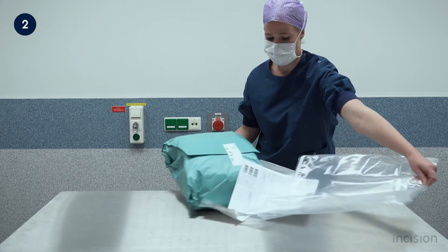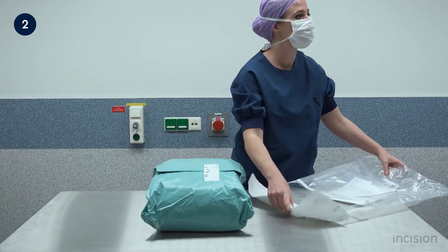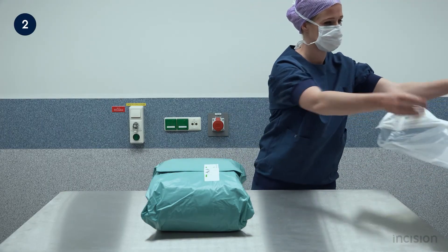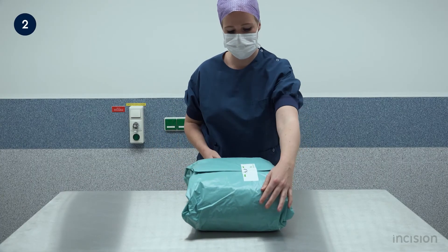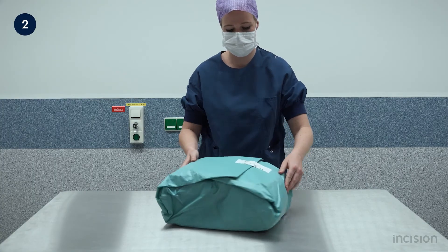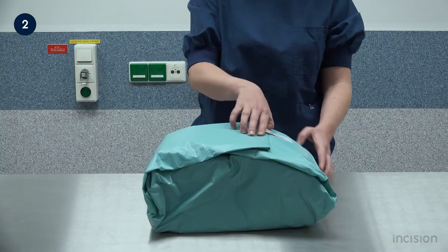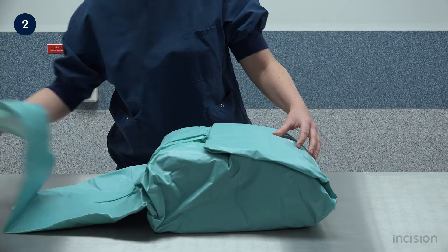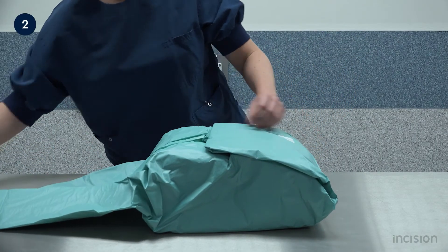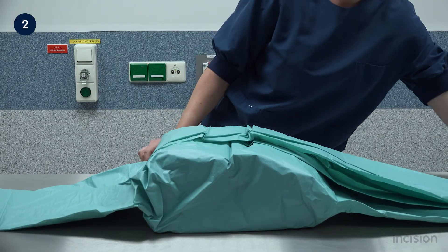The plastic outer covering is discarded and attention is now turned to the sterile packaging material covering the procedure pack. Take note of how the pack has now been turned so that it can be opened lengthwise along the back table. Take note of how the scrub nurse uses the tips of the fingers to handle only the very edge of the sterile packaging material.